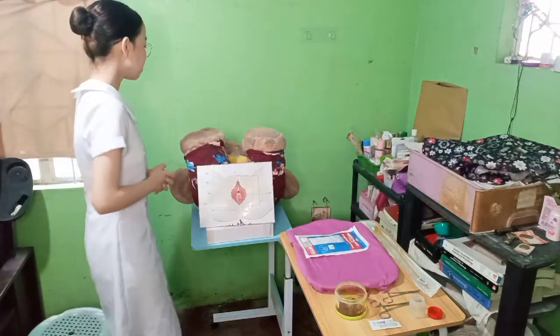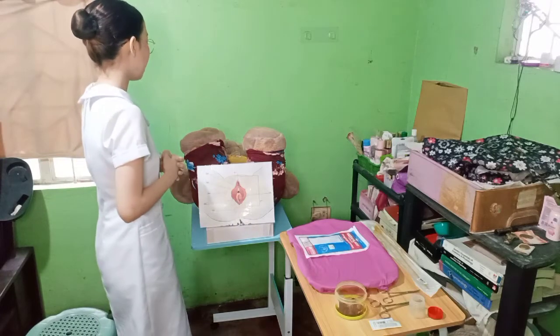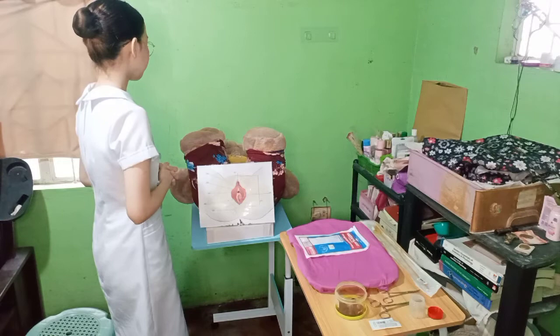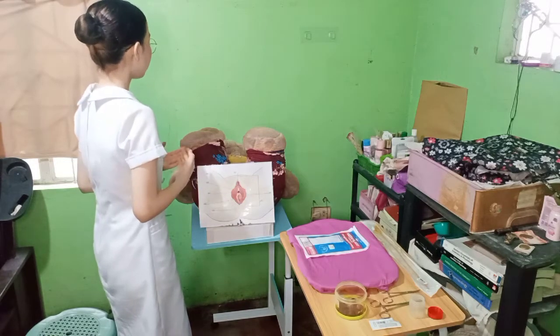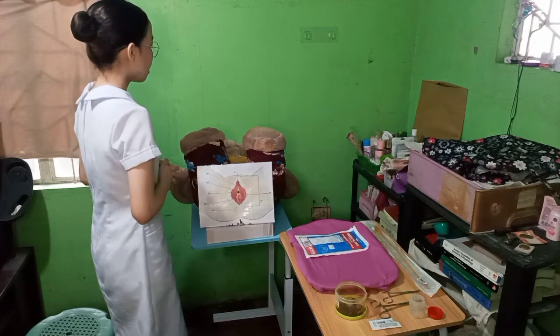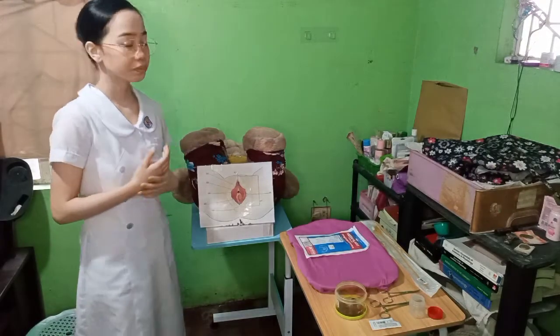Good morning, ma'am. I'm Chanel Valde, and I'll be your attending nurse for today. May I know your name, please? Alright. What would you like me to call you today, ma'am? Okay, Mrs. Reyes. You can identify your patient by asking her directly or by looking at the client's wristband.